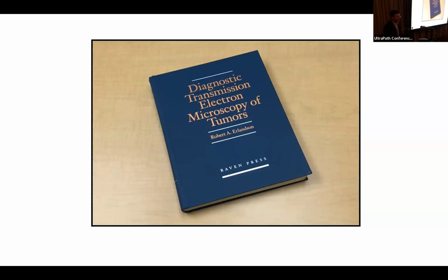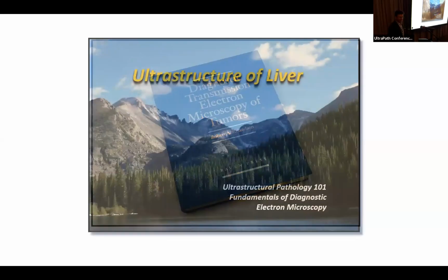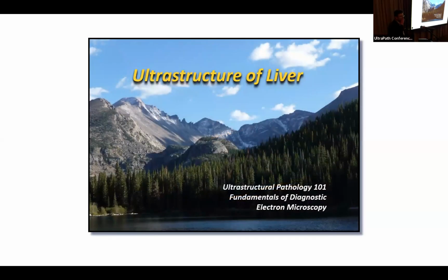Can I say one more thing? Mm-hmm. You've been referring to immunohistochemistry and EM. For the general pathologists and the trainees and all those people that might be here, immunohistochemistry tried to take the place of EM and has in many cases. 75 to 80% of the cases can be solved by immunohistochemistry, but with such small amounts of tissue, you can't use all these antibodies.